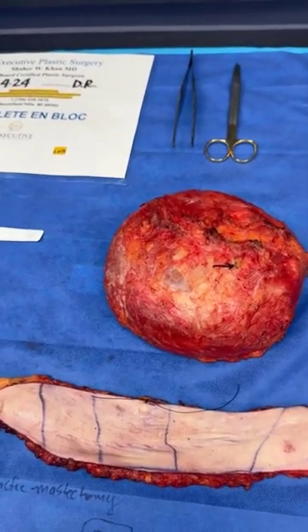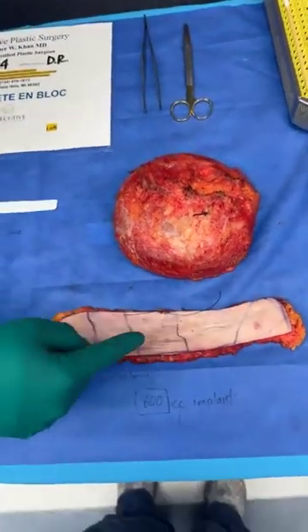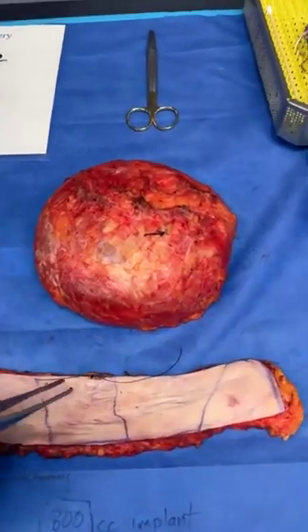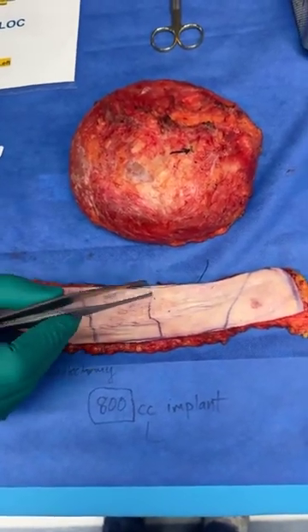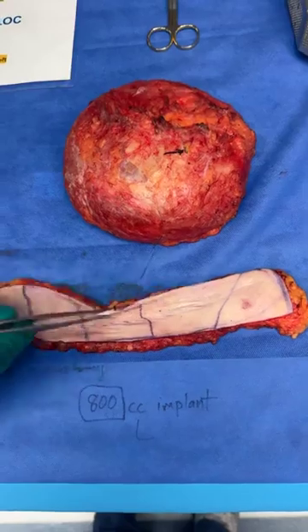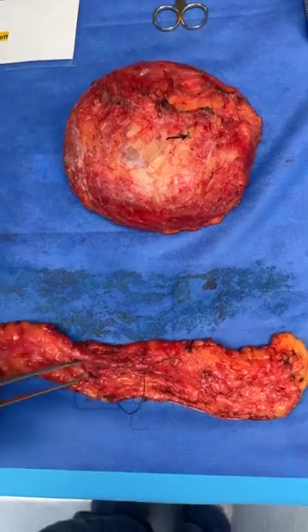I'm going to focus on the left side. Now this is the large piece of mastectomy flap. This is your artificial nipple that was reconstructed. If I flip this over, I oriented at 12 o'clock, so we know this is the lateral, this is the medial, this is the lower part. And you can see how thin this flap was. So you can see right here.